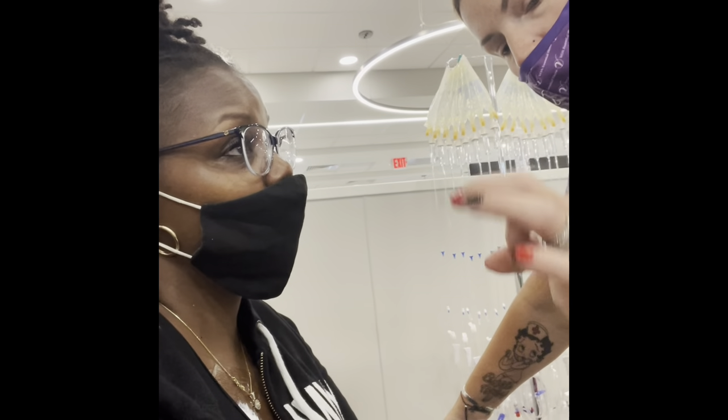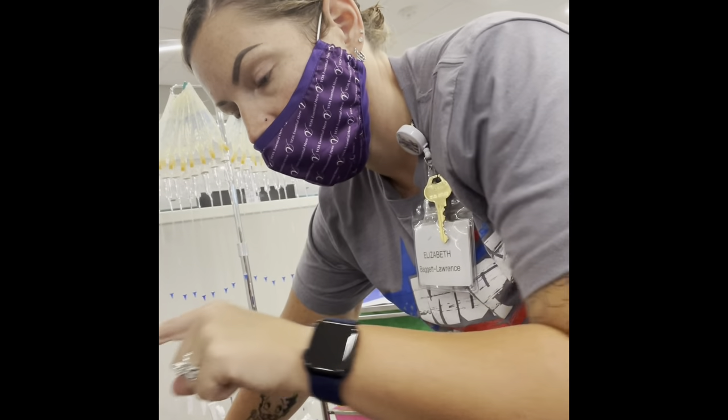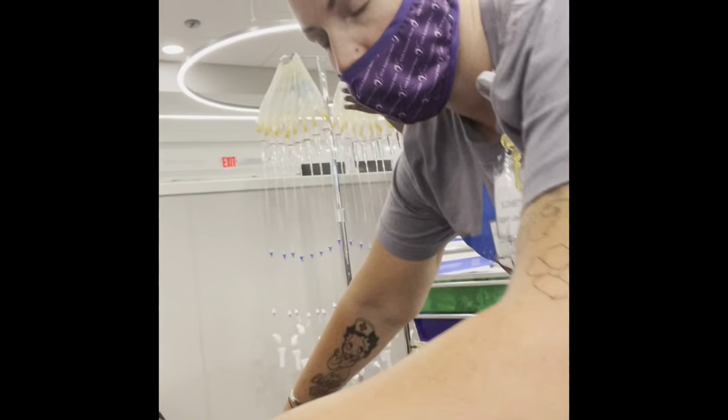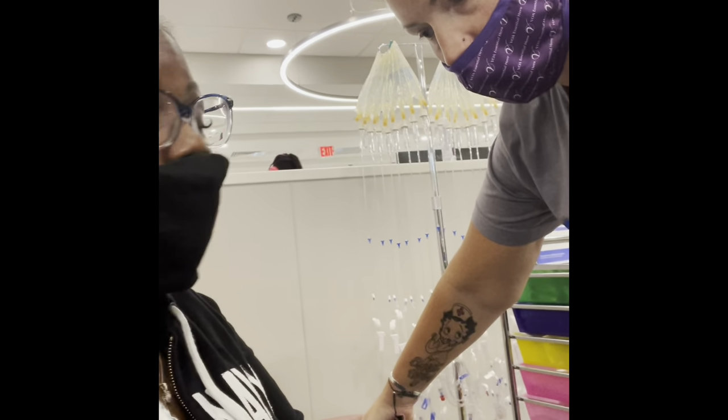When you put it on, you want to put on like a quarter-size amount right over where you see the port, and then you're just going to cover it with a dressing just like that. You want to put it on like 20 to 30 minutes before.